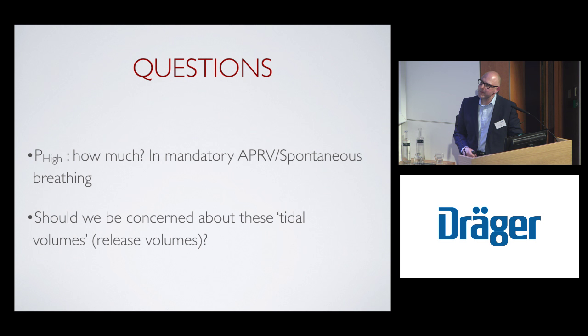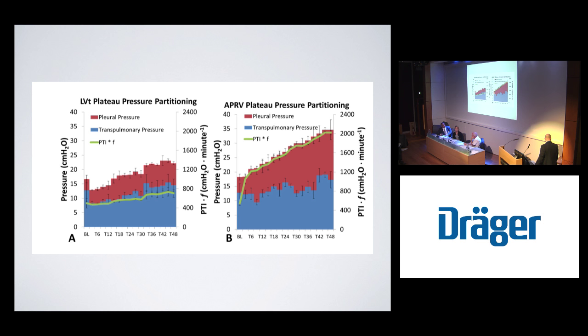Okay, so I think that's a great point that you made about considering the transpulmonary pressure, because although attractive, the universality of using one number, such as a plateau pressure, to fit all of our patients, whose phenotype is completely different, may not make a lot of sense. To some degree, you have to consider the type of patient you're ventilating. If there's any question, and you have the opportunity to use esophageal measuring, you should. But you certainly don't need that to suppose that this patient would require a lot of pressure.